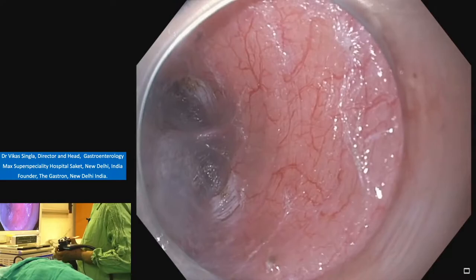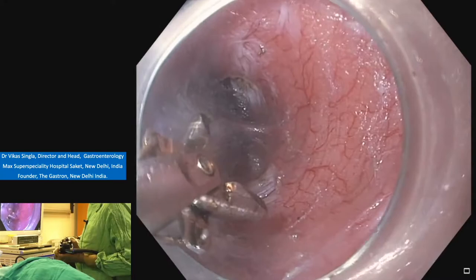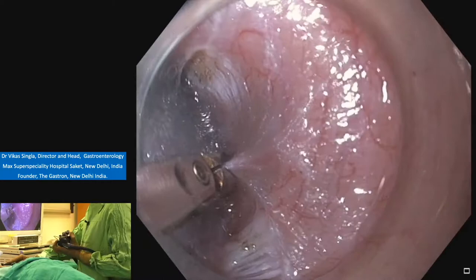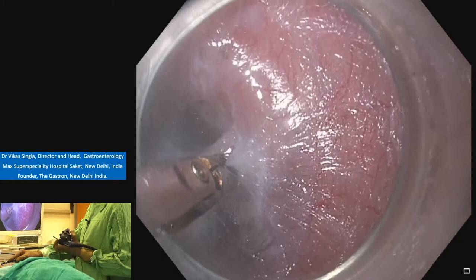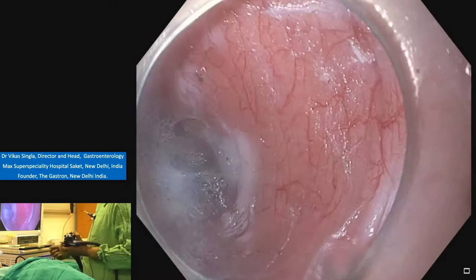Again the same steps again. Use the coagulation. Open. We'll coagulate till the vessel becomes white, then use the cut current. Effect 2, duration 3, interval 3.